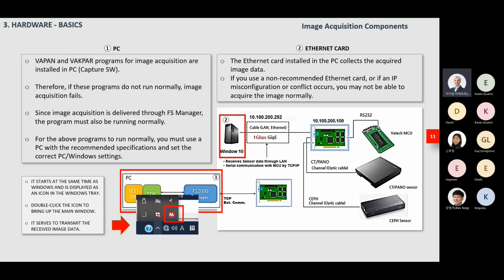And you will need to first check two things: if there is proper communication between the PC and the card, and if the IP has been properly configured.